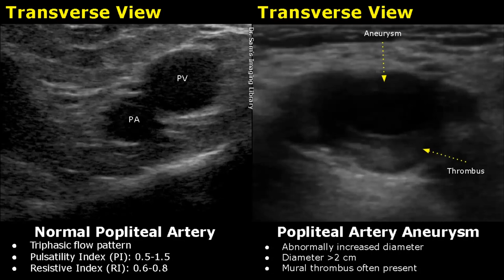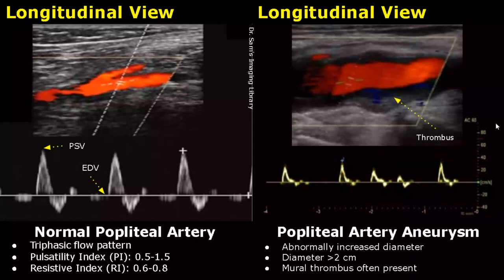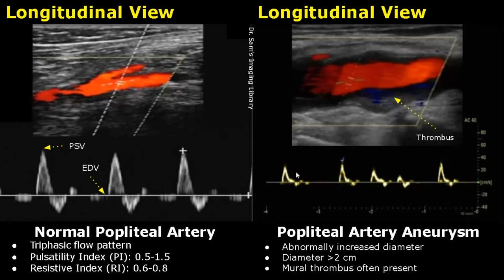The spectral Doppler waveform can be normal in a popliteal artery aneurysm — this waveform is normal and triphasic. But in the image, we can see a mural thrombus and an abnormally increased diameter of the popliteal artery.